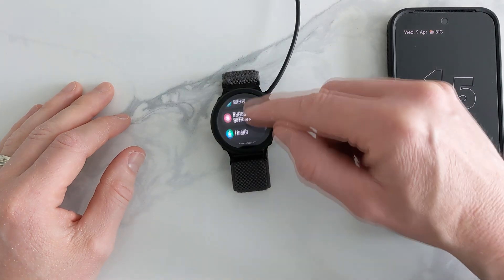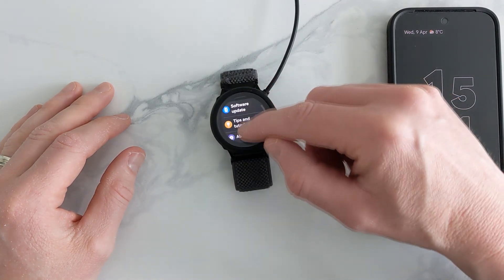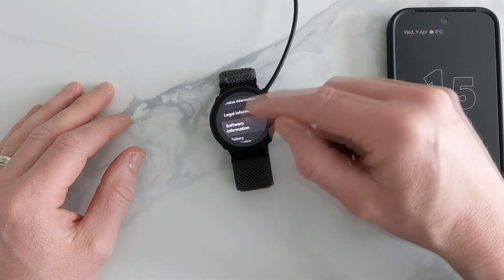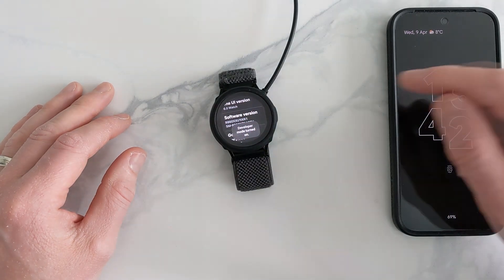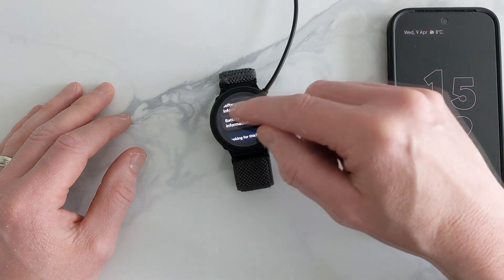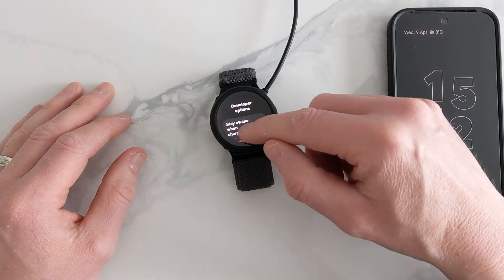First, press your options and scroll right down to 'About Watch.' Then go to 'Software Info' and tap on the software version repeatedly until development mode turned on appears. Back out of this and you'll see the development mode option now available.